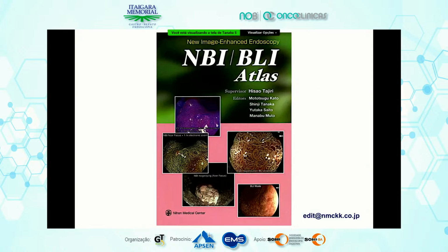This atlas was published by Professor Tajiri, Professor Kato, me, Yutaka Saito, and Muto Manabu. This atlas contains NBI and BLI from the upper GI to the colon and rectum. If you are interested, please buy and learn from this atlas.